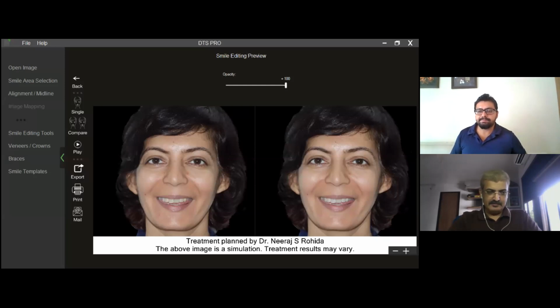And one more question I have is, can we export this to a mobile, like the patient is sitting there and we can just export it immediately, or we can export it by email, or in what way can it be done?